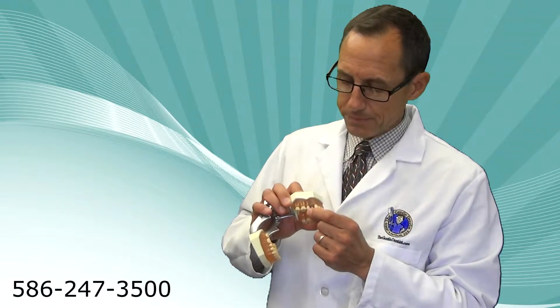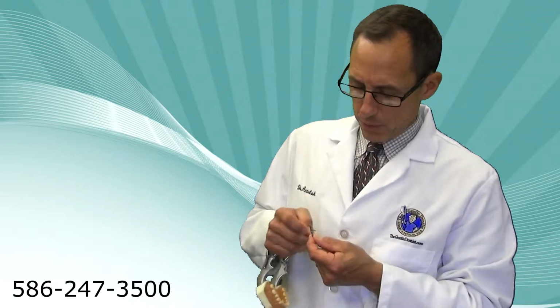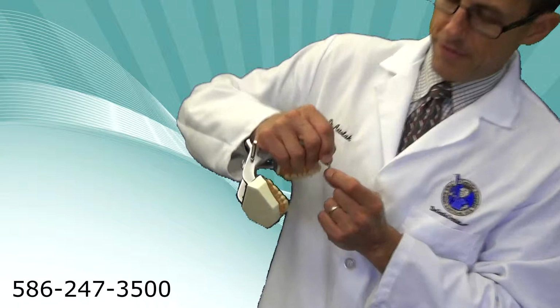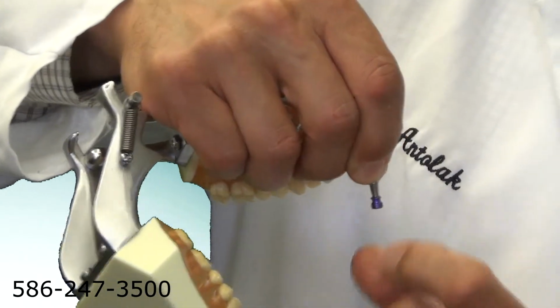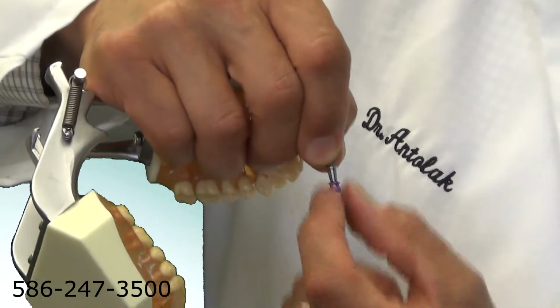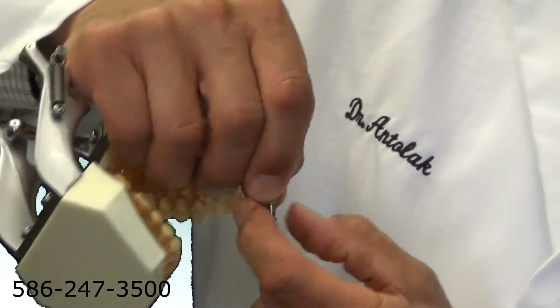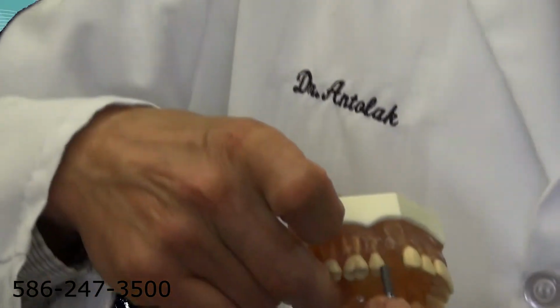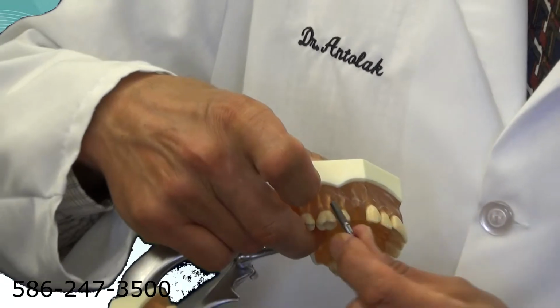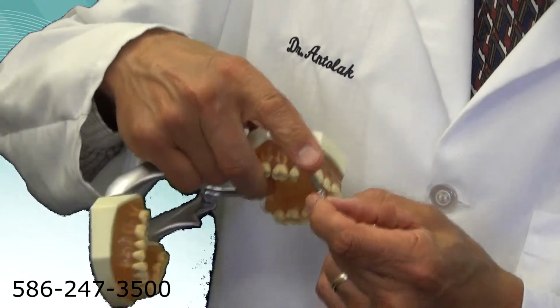It works just fine. Then on top of that implant, which is really right here between my fingers, that part is called the abutment. That abutment actually unscrews from this implant, and then the abutment looks like a tooth itself. That would be the part that sticks out, and then we can create what's called a crown that would get cemented over the top of that abutment.